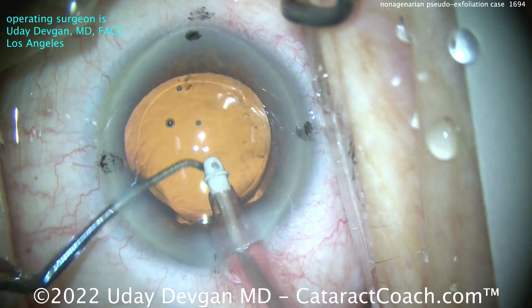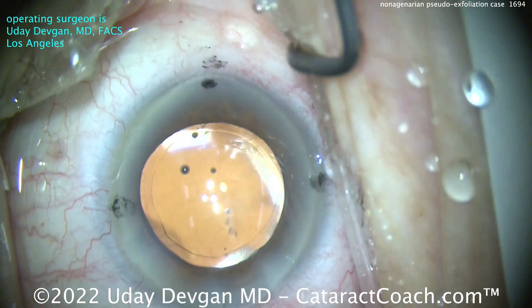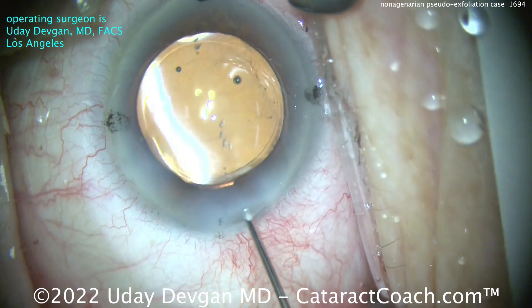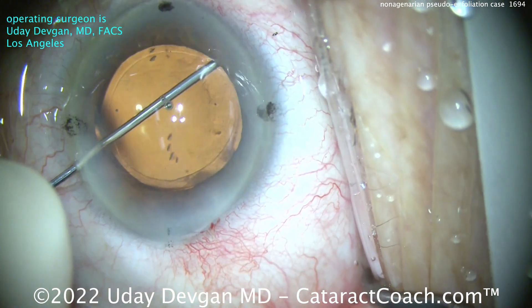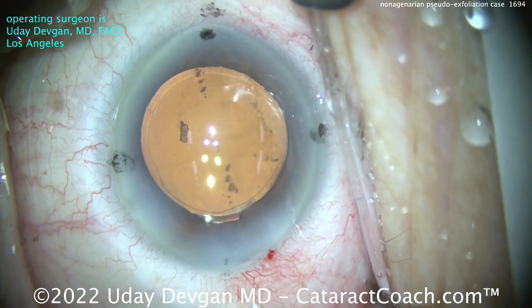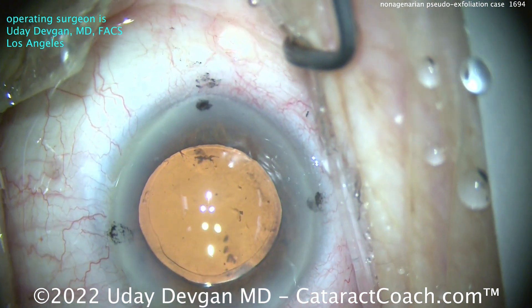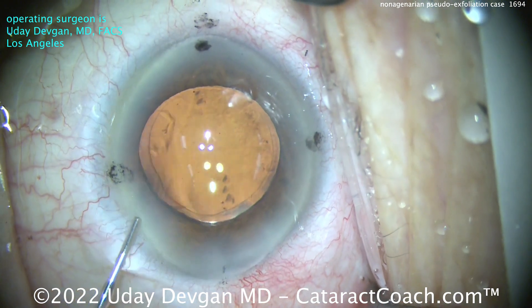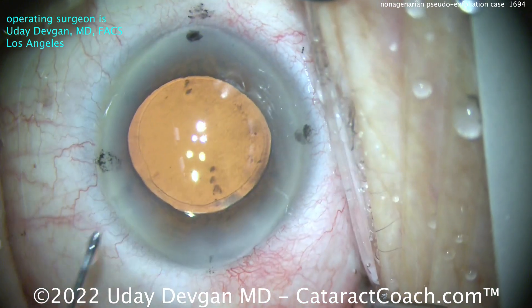Let's rotate that toric lens around a little bit and get it precisely aligned. If you are so inclined, you can use an intraoperative aberrometer to check the alignment of that lens, but I know it's pretty darn good. Let's seal up the incision here and make some final adjustments. You can see a beautiful-looking rhexis, and those dots nasally on the cornea match up beautifully with the dots on the IOL — and the same thing temporally. A little bit of last washout here at the end. That's a beautiful case, and the patient had a fantastic outcome and was quite pleased. Even though the pseudoexfoliation was relatively extensive and it's a nonagenarian, I did not feel the need to use a CTR. The capsule support was actually pretty good. Making sure we get out all that viscoelastic, because I don't want any pressure spikes in the post-op period. And we're just about ready to call this done — a case that I enjoyed performing.